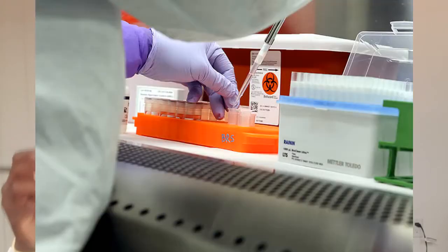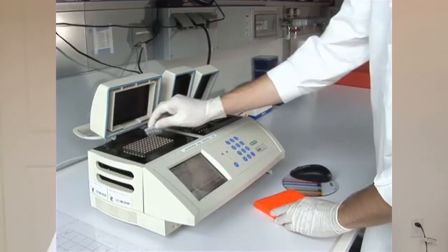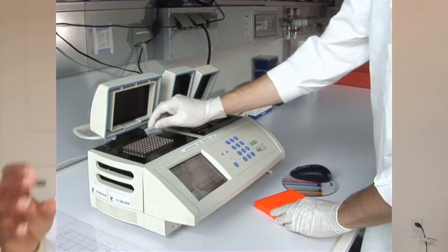So what is the next step? After extraction, the MLT must carefully pipette a small amount of the sample into a master mix. So after the extraction, we get another test tube where the sample gets pipetted to be tested. Another step is that once the sample is mixed, it is put through a PCR, and basically what the PCR does is detect whether the sample is positive or negative.